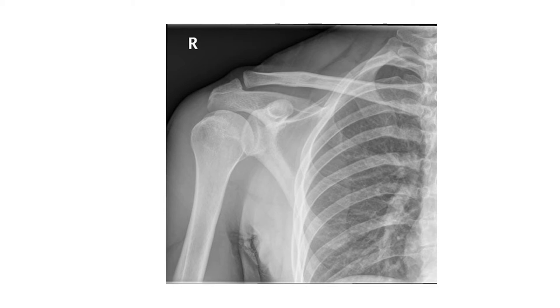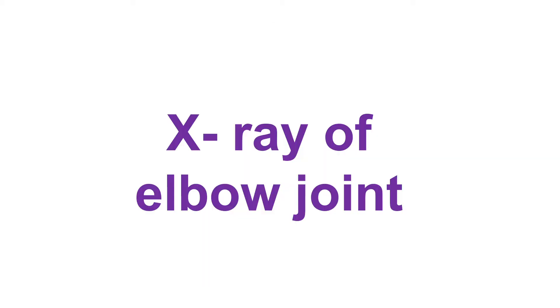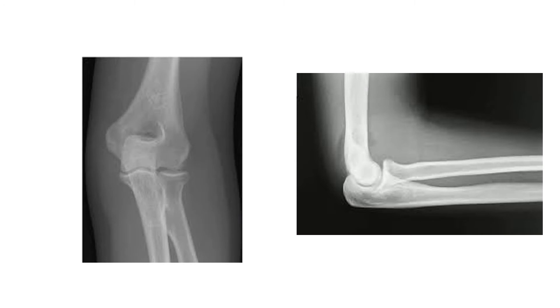From this x-ray we ask these questions repeatedly. Now, the x-ray of the elbow joint. This is the x-ray of the elbow joint AP view, and this is the x-ray of the elbow joint lateral view.